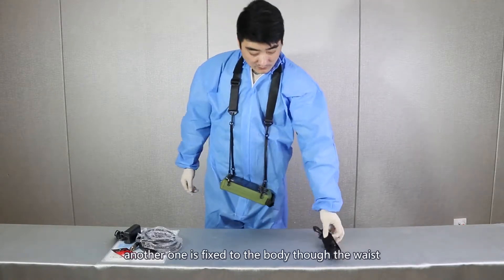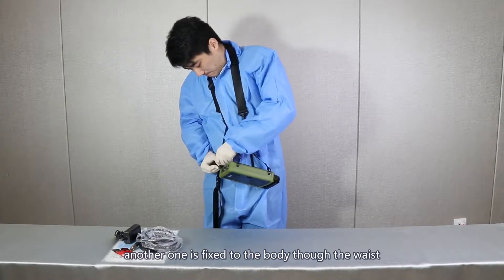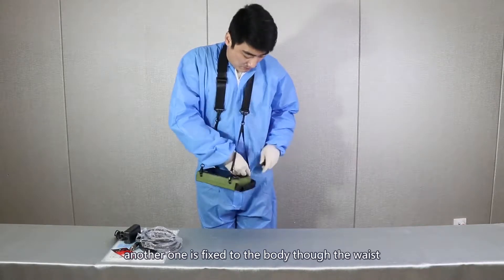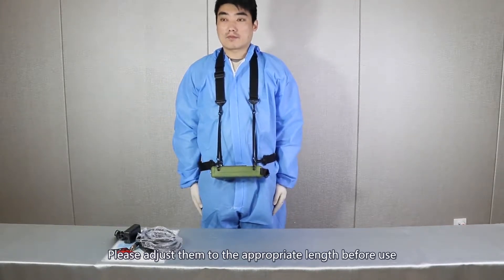Another one is fixed to the body, through the waist. Please adjust them to the appropriate length before use.